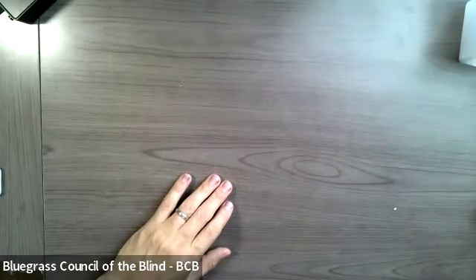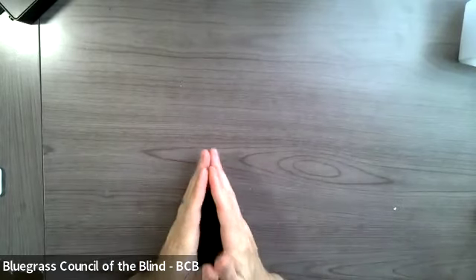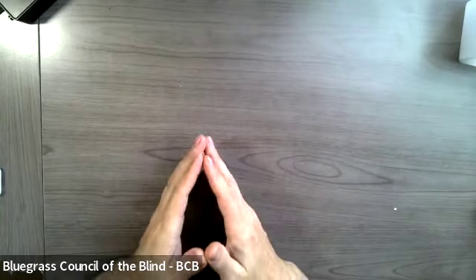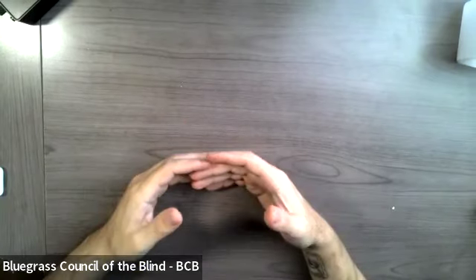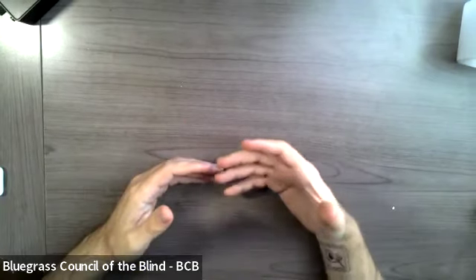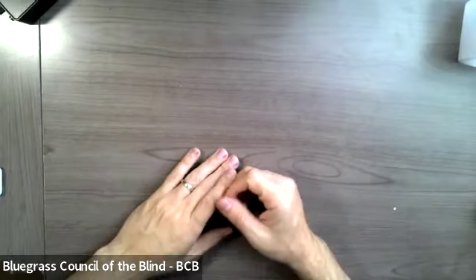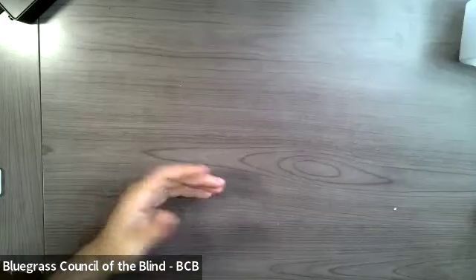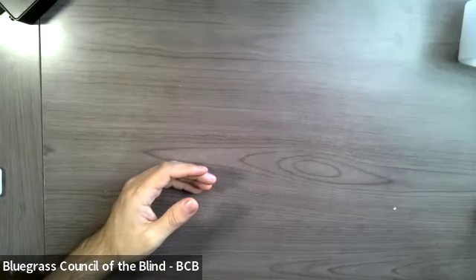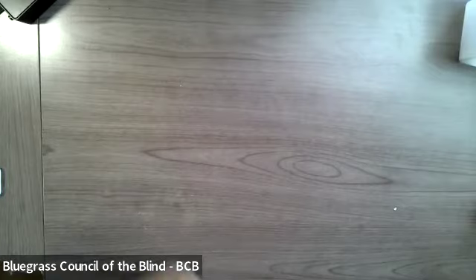We have three different types of canes. You have mobility canes, full-size mobility canes that are used for daily driver cane users. These are the types that if you're a full-time user, you're going to be using this type of cane. They're super strong and durable. They also have identification canes. They are skinnier, more lightweight, and used primarily for just that identification. And then they also have telescopic canes. And I'll show you a quick example here.